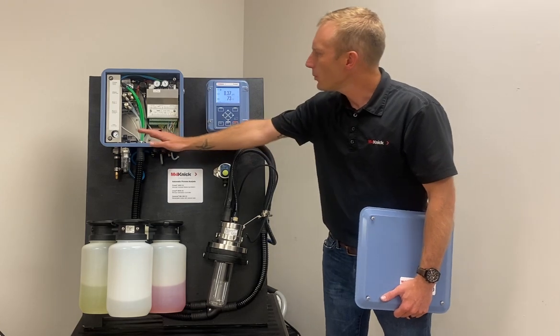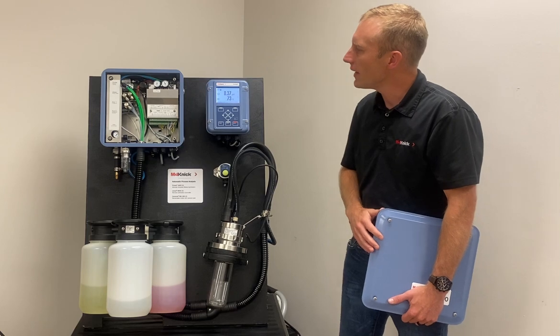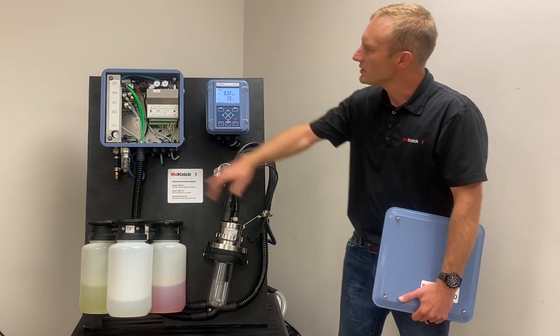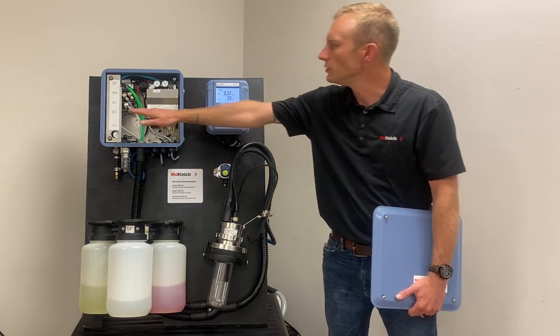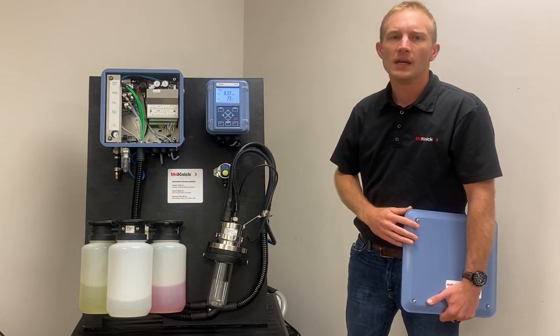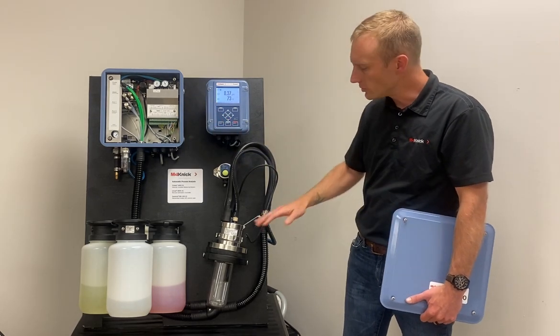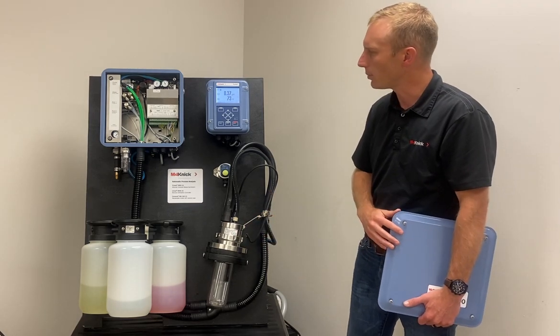This operates off of 4 to 7 bar air pressure, and for water rinsing 2 to 6 bar — so you're going to bring your utilities into here. We've got a number of solenoid valves and we have the ability to incorporate additional auxiliary valves if we want to bring additional chemicals into the system for cleaning, or air or nitrogen for purging of the cleaning and calibration chamber prior to inserting back into the process.